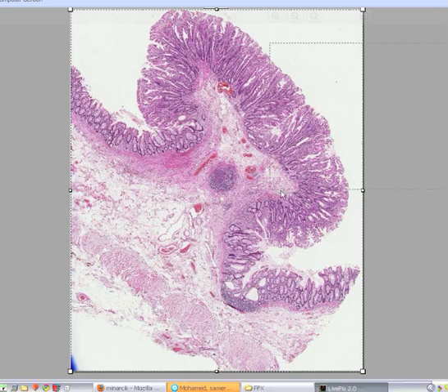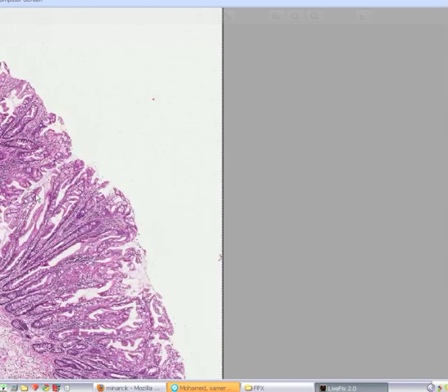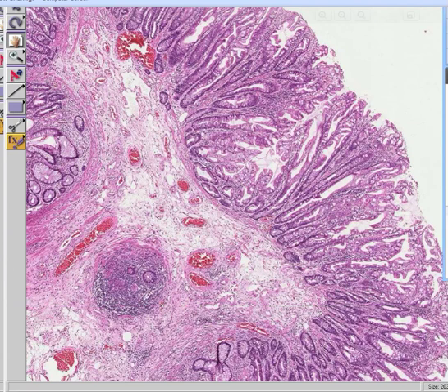But nevertheless, let's blow this polypoid area up a little bit more. So now you have to decide whether this is an adenomatous or hyperplastic polyp. And in about 10 seconds, I think you'll all see it. Do you see the blow up, folks? I'm assuming most of you probably do. Okay, good. So do you remember when we talked about neoplasms?